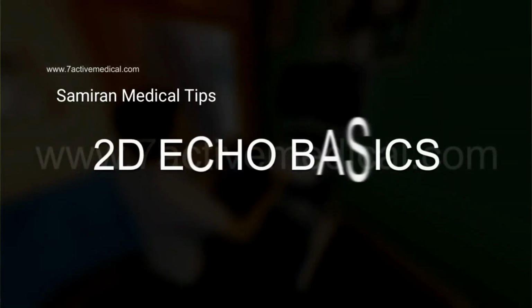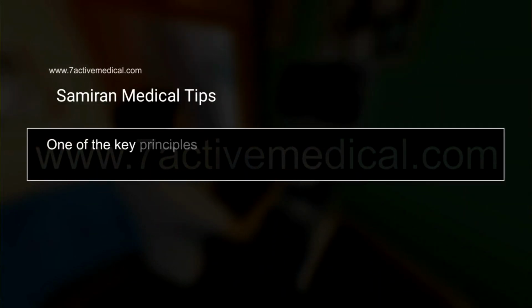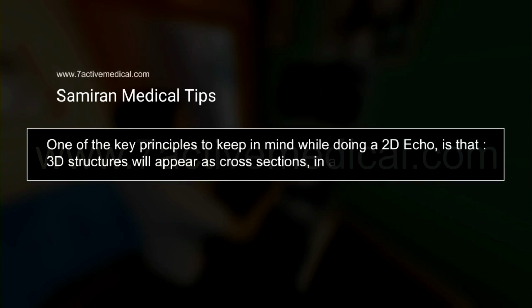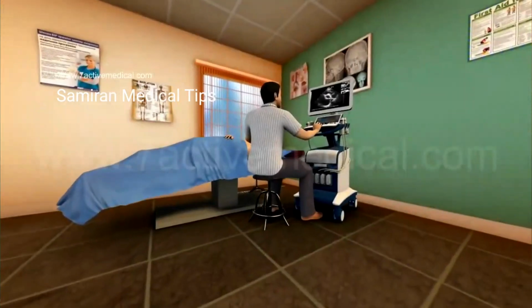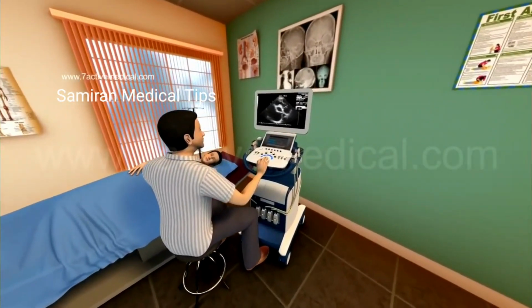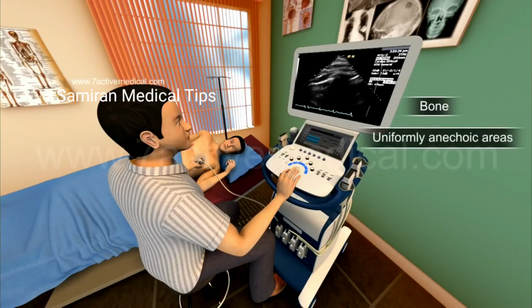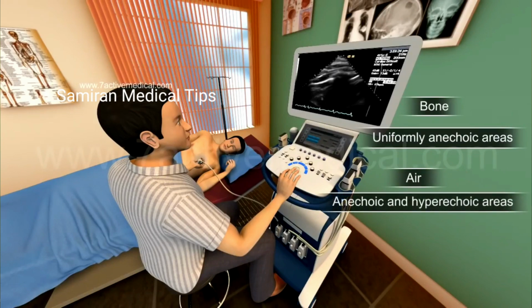2D Echo Basics. One of the key principles to keep in mind while doing a 2D echo is that 3D structures will appear as cross-sections in a two-dimensional plane. While fluid and solid organs conduct sound, bone and air do not, resulting in anechoic shadowing or dark areas. And as bone is uniformly dense, uniformly anechoic areas are seen, unlike with air, which has the classic shimmering effect because of a mixture of anechoic and hyperechoic areas.